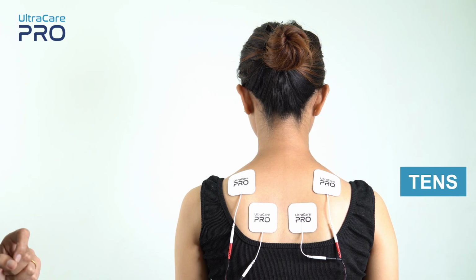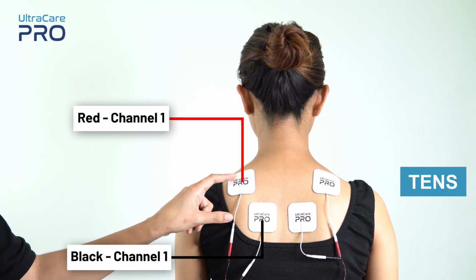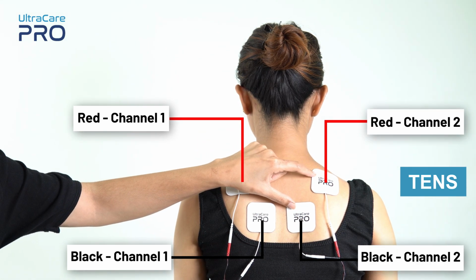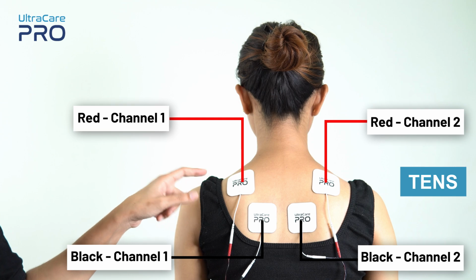For upper back application, place red and black wires from channel 1 on one side of the upper back region. Similarly, place the red and black wire from channel 2 on other side of the back region in a way that the areas that is painful for upper back gets covered.